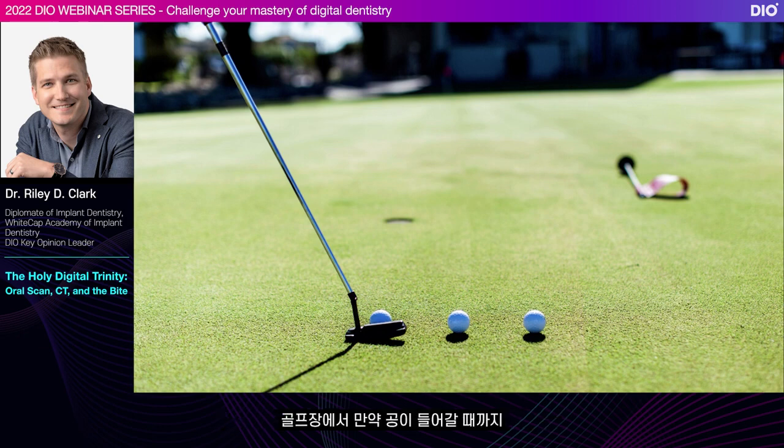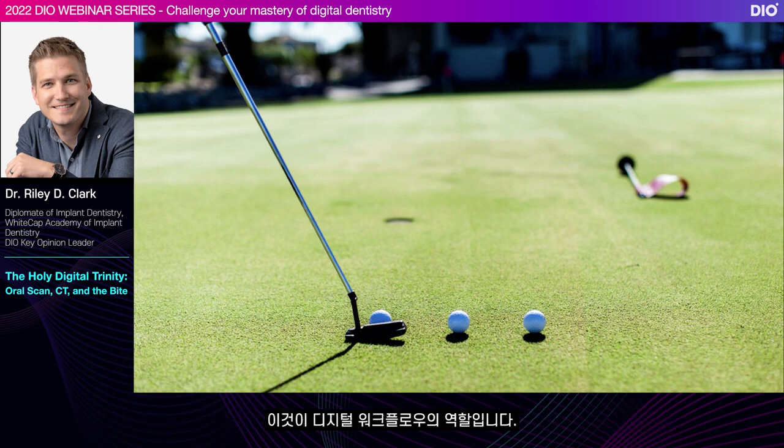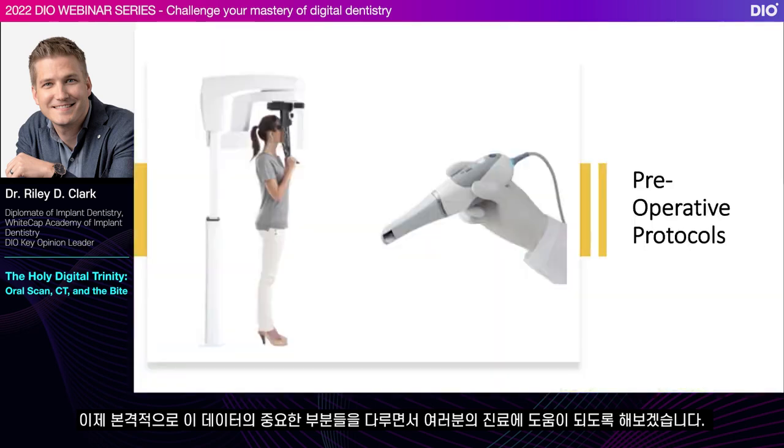Just like on a green, if you had endless putts and you kept getting opportunities to hit a putt until you made it, and then that's the one you stick with, that's what digital workflows represent, and that's what these data sets give us an opportunity to do. So with that said, let me jump in and share some pearls about this data that might help you be more successful in your practice.